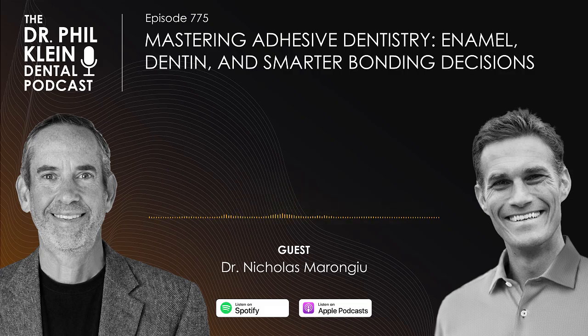The chemistry is a big part of it, and it's not all upside. As these generations come out, we get fancier with our bonding. I always consider the generations early on, 1, 2, 3, 4, and up into the 5th were pretty consistent. And after the 5th gen, it becomes a little bit more gray regarding steps and protocols.